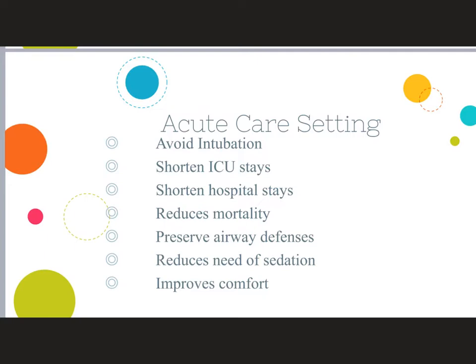What are some disadvantages of an endotracheal tube? So some disadvantages, we talked about bypassing the mucociliary escalator. They may be on the vent longer. It's more expensive for the ventilator. We are increasing the risk of infection, a viral or bacterial VAP. So VAP is a ventilator-acquired pneumonia.